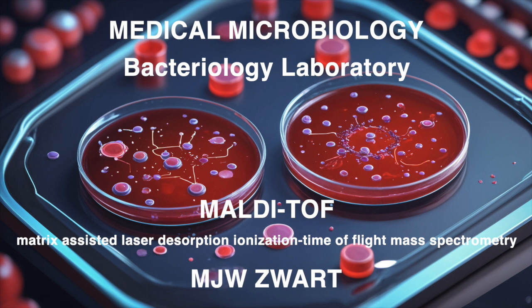Fresh BTS if it fails again. Troubleshooting time, either that source cleaning or call Bruker. You got it. Mastered the art of troubleshooting.